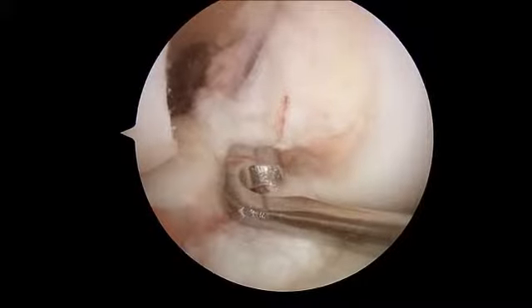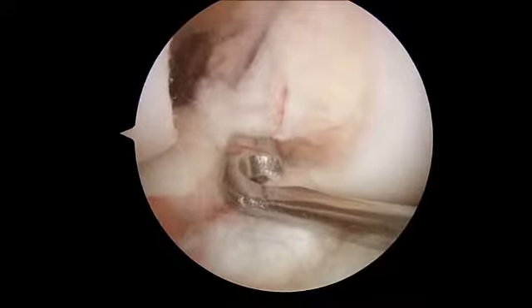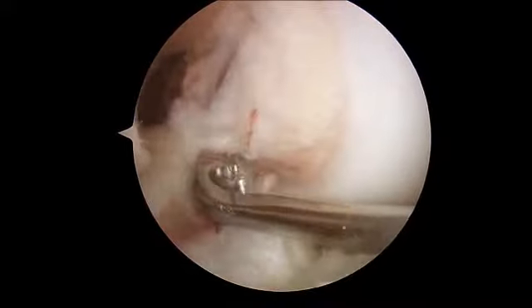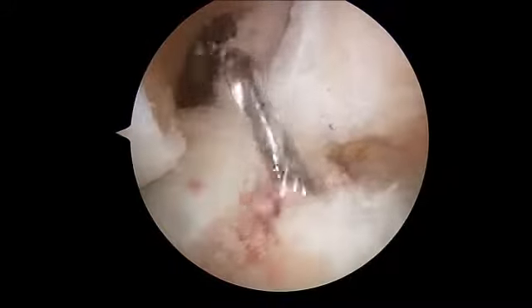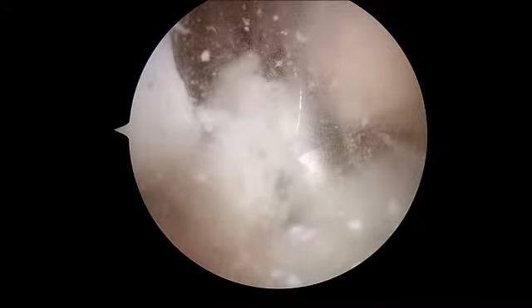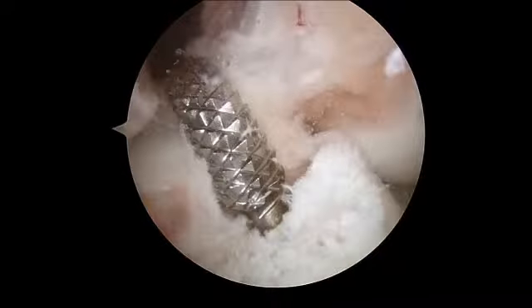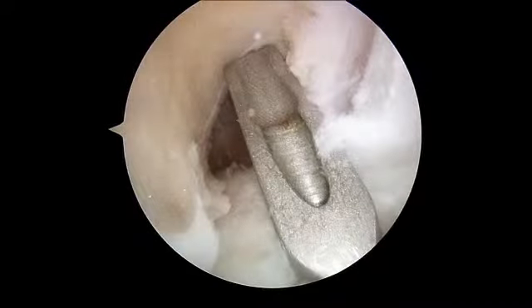The first thing we do is use a set of guides with very specific angles. You can see the crosshairs, the laser marks in this guide, and I have a drill coming from outside of the knee, and it comes up into the knee. This is called a cannulated system, so we have now a reamer that's coming over our first drill bit, and this is a 10 millimeter reamer creating a 10 millimeter tunnel in the tibia. The little rasp created a nice smooth edge, and now we're going up to the femur.